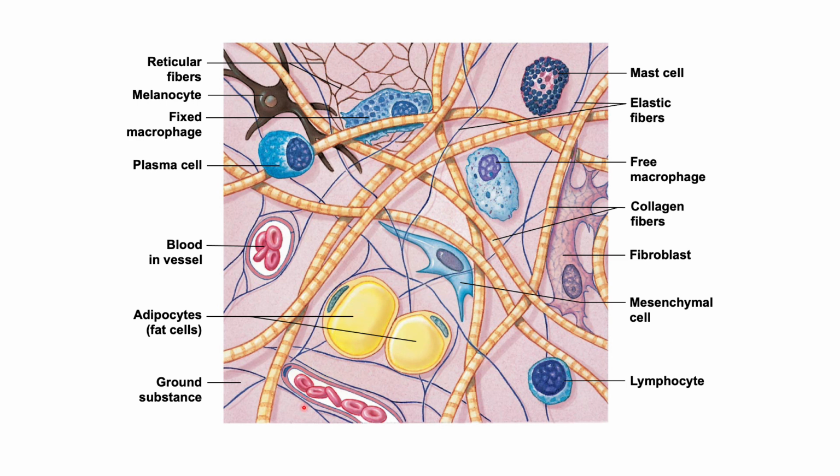So the first thing I want to talk about would be the background, which is like this pink thing you're looking at. This is the ground substance. I like to call it the background, the filler. This is where the foundation is.